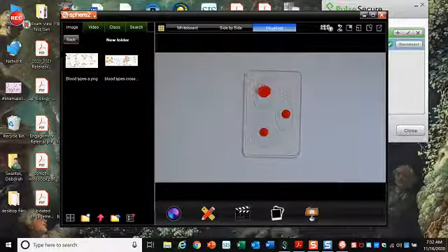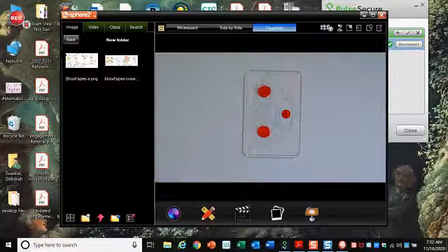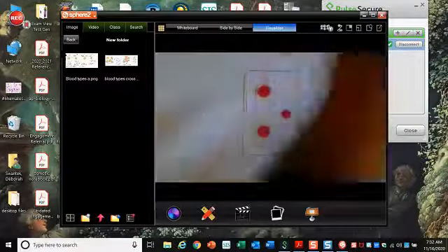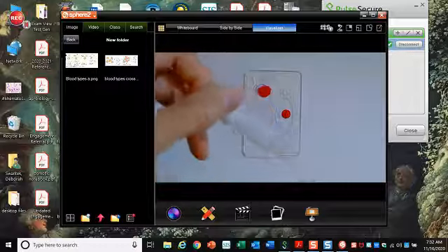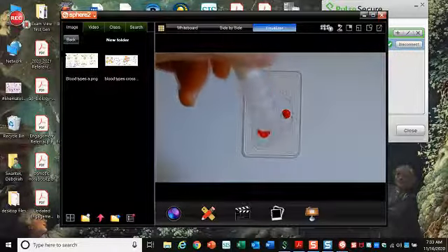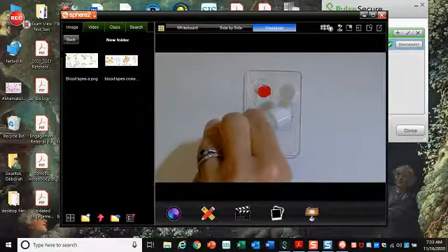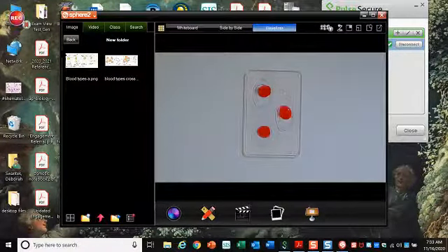You can also see that these are colored blue, yellow, and then the last antibody on our bottle, hard to see this one because it's white, is labeled anti-D. This is the anti-RH antibody. So I'm going to add that to the 3rd well that says RH.